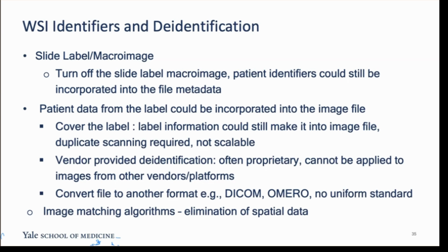de-identification platforms. And finally, there is a minuscule risk that image matching algorithms can take any part of a WSI, do feature extraction, and either identify or, if not, narrow down a possible patient group. And the only sort of protection against that is to just eliminate spatial data in a whole slide image. So these are the different ways where patient information can be part of a whole slide image.